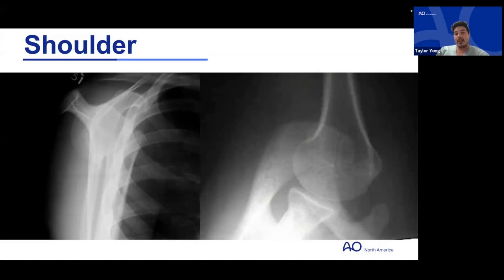I don't know, what do you guys think, is that a big no-no where you're at? What do you guys think about CT scans in certain fractures, to make sure that the glenohumeral joint is reduced?